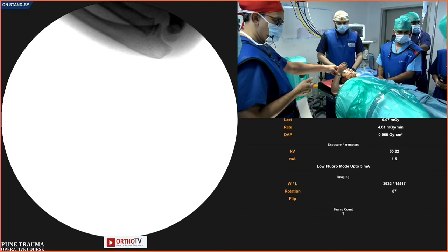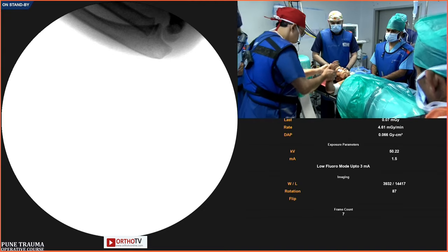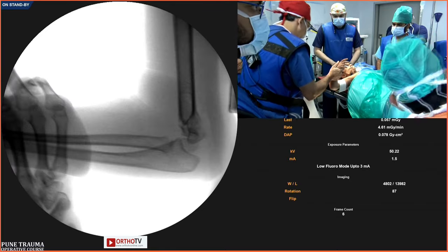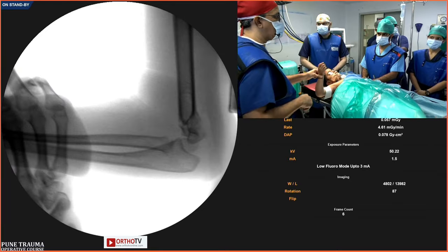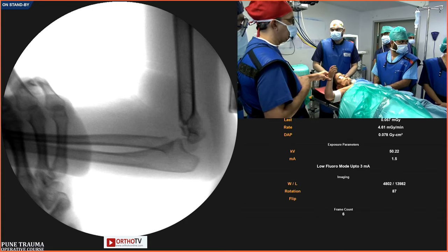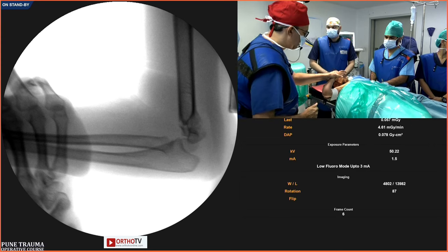Any reason why you keep the humerus short of the elbow? Meaning, why don't you have it short of the elbow? The distal fragment has to be off. Now you can see it on the lateral view. When I am at 90 degrees, it is still extended. So for reduction, I need acute flexion.